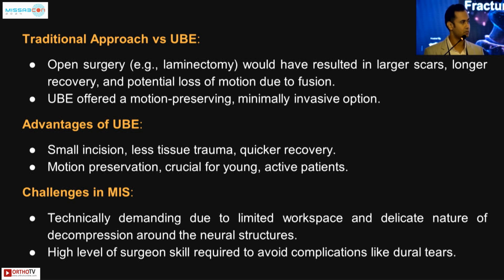The advantages include small incision, less tissue trauma, better magnification with more safety. But the challenge is that it is technically demanding because of the limited working space and delicate nature of the decompression on the neural structures.